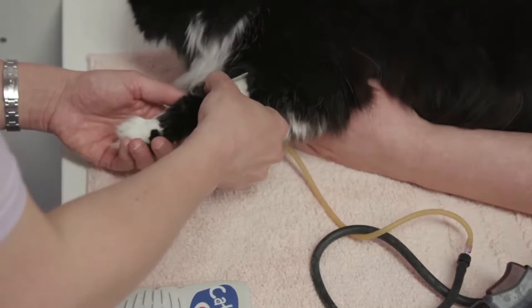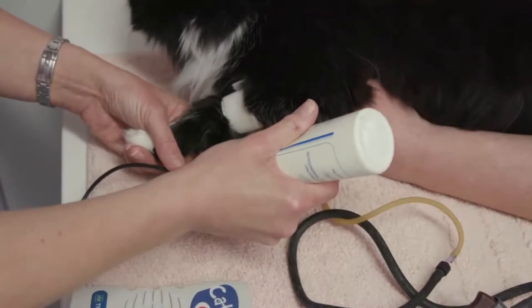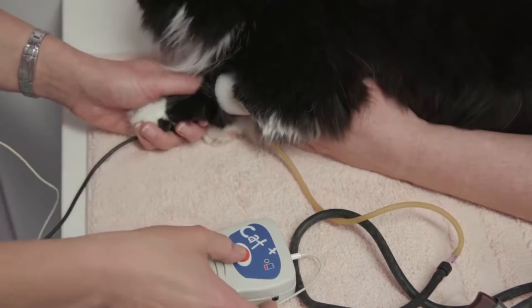We're then going to place some ultrasound gel over the common digital artery and also directly onto the probe of our Doppler blood pressure machine, and using just very gentle pressure listen for a pulse signal.